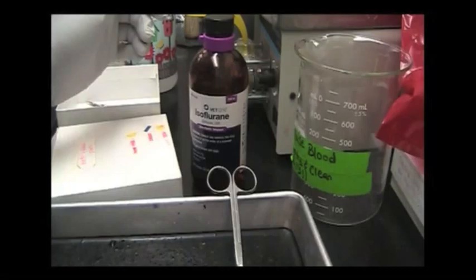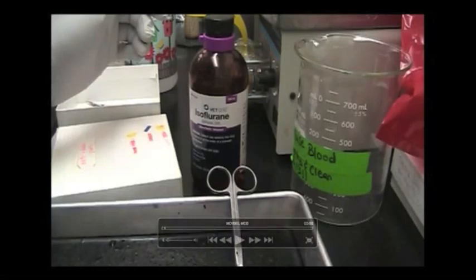The first thing we need to do is, you will see this chemical in the background called isoflurane, and this is actually an inhaled anesthetic. So what this is going to do is essentially knock the animal out so that they can't feel any pain. Every single time we conduct an experiment like this, it needs to be done in a manner in which the animal cannot feel any pain, and this is done by using isoflurane in this case.